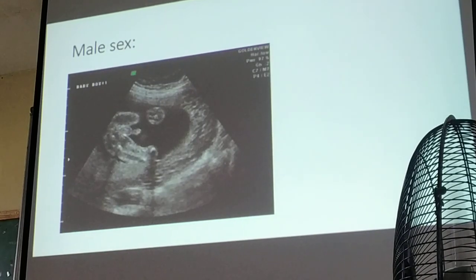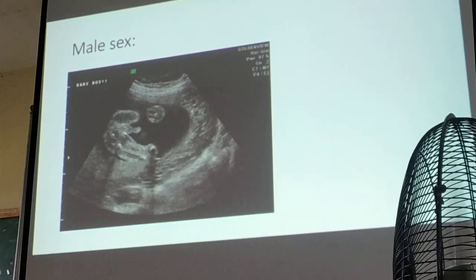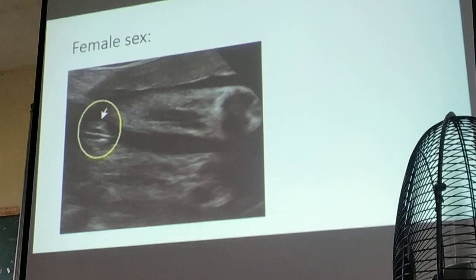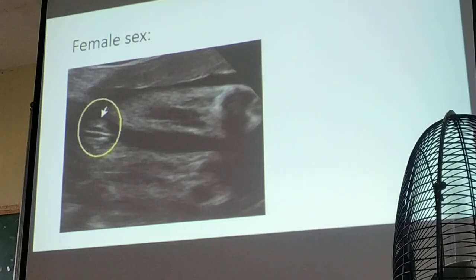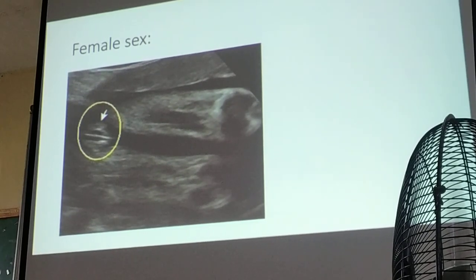And then the turtle sign, identify the sex. So that would be male, and the burger sign would be the female. If I'm going to ask you the sign, please burger sign, not female sex. If I'm going to ask you identify the sex, then female sex, male sex. But if I'm going to ask you the sign, turtle sign or the burger sign.